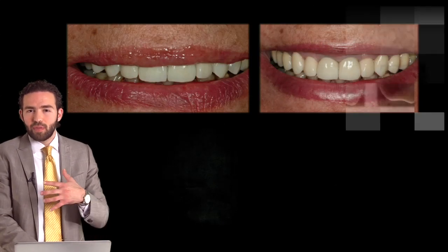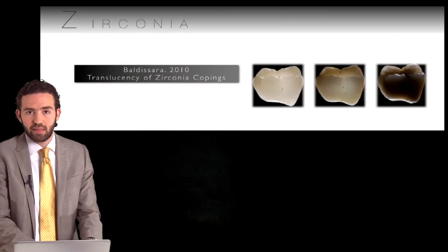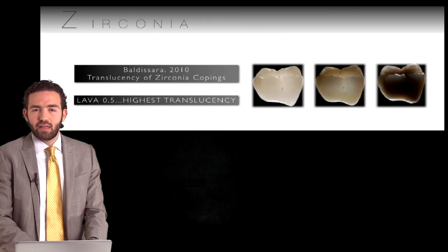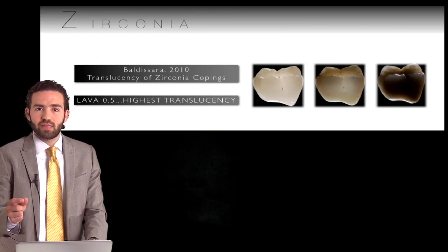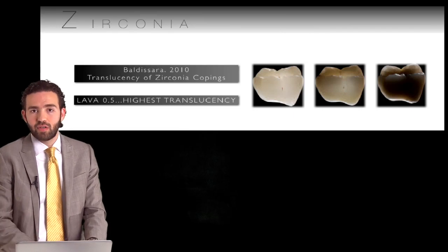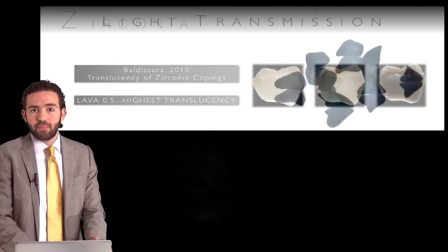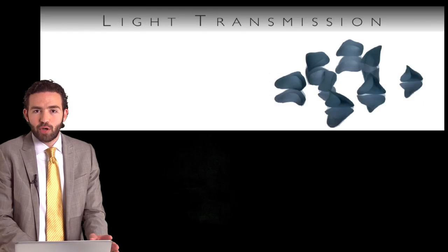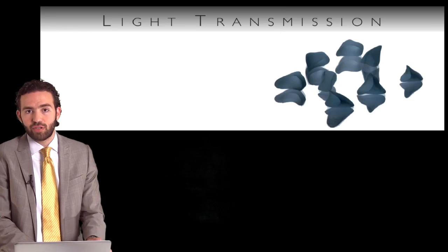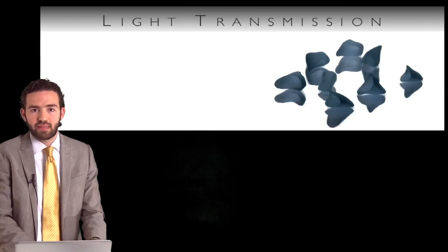Everything is summarized in terms of translucency and opacity in this study done by Baldissara. The conclusion is that zirconia restorations within a 0.5 millimeter thickness are very translucent, almost as translucent as Emax restorations. So, to answer the question of whether zirconia is translucent: yes, it is translucent, especially if it's used in thin sections, which in dentistry we always go for because of lack of space.